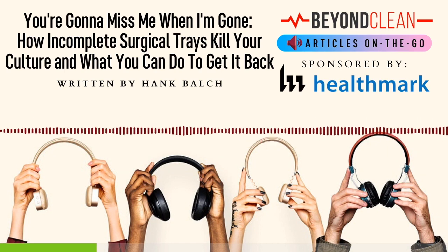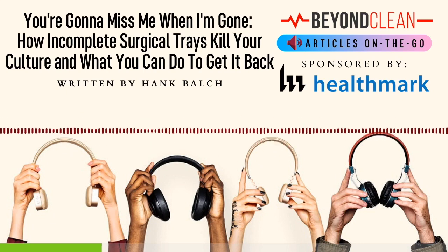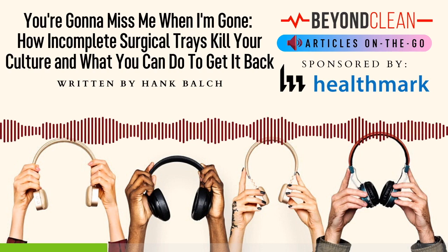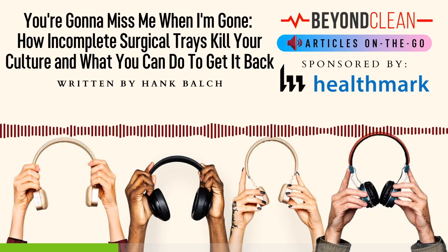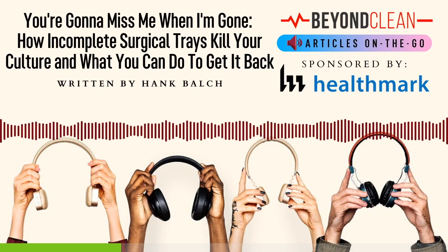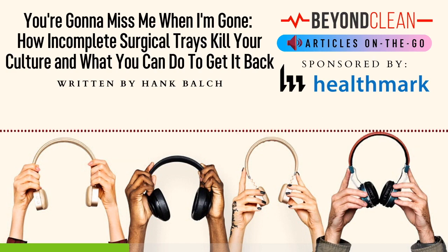1. Tack yourself before you wreck yourself. A sterile processing technician is only as good as the tools they have to do their job. In terms of tackling a missing instrument list, you will need the best data possible located in all possible places. If you do not utilize an instrument tracking system and don't have the capital to purchase one, comb through your paper count sheets to ensure every listing is as up-to-date as it can be, including cross-referenced instrument catalog numbers.